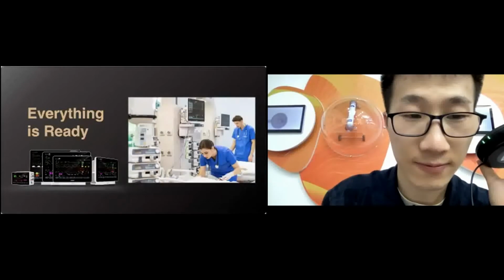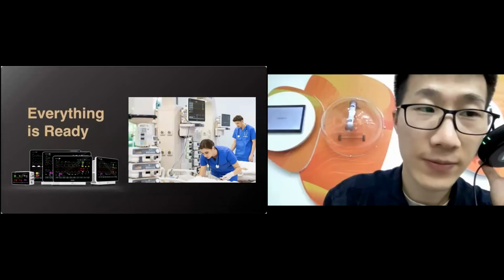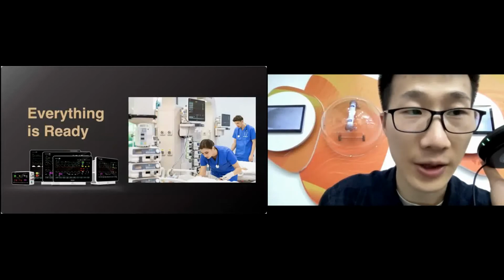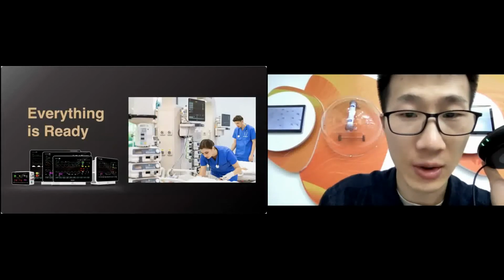Sure. Regarding the early warning score, we know it gives a score based on an algorithm, and this algorithm is based on multiple parameters from the patient. This score shows whether the patient's situation is getting worse or becoming more stable. It is a scoring system that evaluates a patient's condition by checking the patient's parameters.